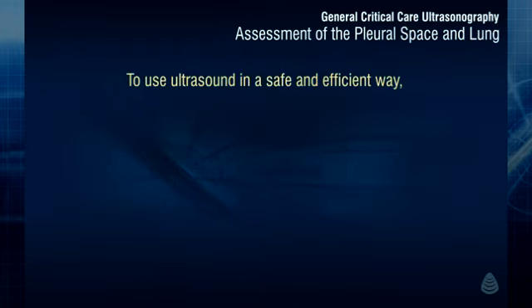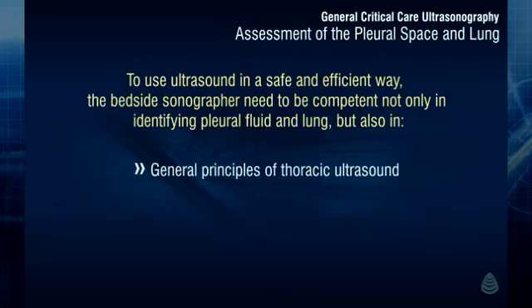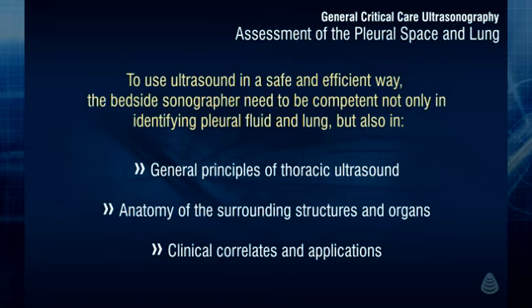In order to use ultrasound in a safe and efficient way, to assess for pleural effusion, to guide thoracentesis, and to assess the lung for various pathological conditions, the bedside sonographer will need to be competent not only in identifying pleural fluid and lung, but also in knowing the general principles of thoracic ultrasound, the anatomy of the surrounding structures and organs, and the clinical correlates and applications of the technique.